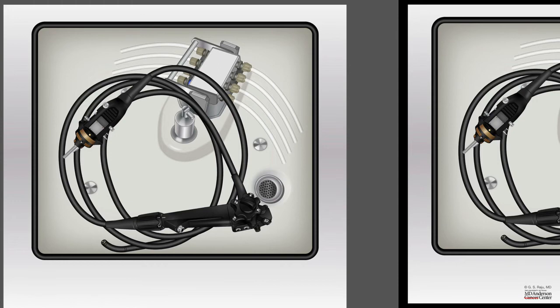It's also important to keep the endoscope loosely coiled, not tightly coiled.